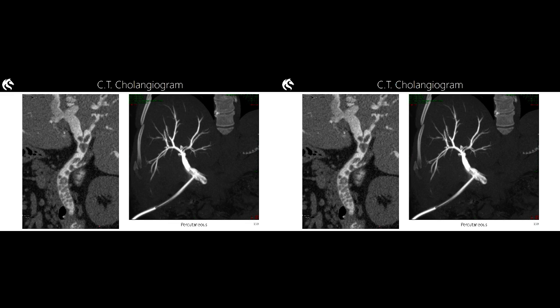If we had a patient who, for whatever reason, we could not drain their common bile duct, the tumour mass of that pancreatic head is just too big, or it's a cancer of their duodenum as well, or for whatever reason we can't get any drainage out, and we wanted to get rid of a patient's bile, then one of the ways we could do it is percutaneously, literally put a tube right in through their liver and into that bile duct, and the patient could potentially be drained through there. If we do have a drainage point, we could also inject contrast into it to make sure everything is where it should be. That's the rough version.